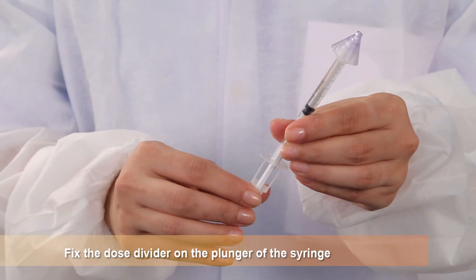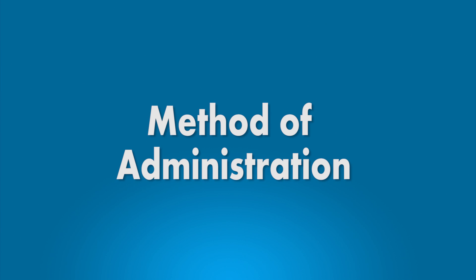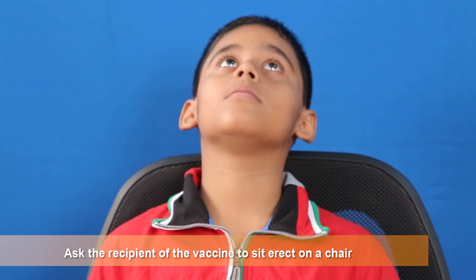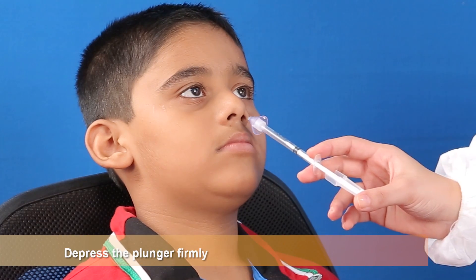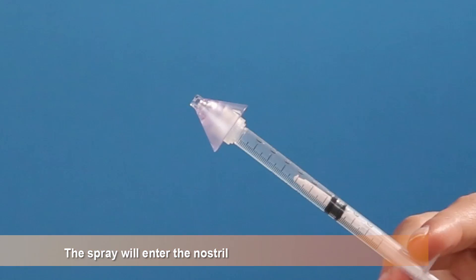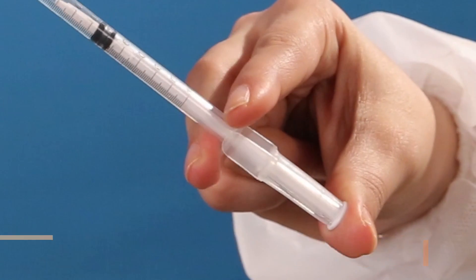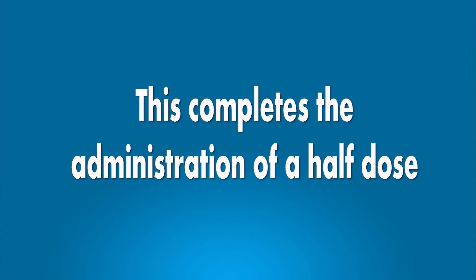Fix the dose divider on the plunger of the syringe. Method of administration: Ask the recipient of the vaccine to sit erect on a chair with head tilted back. Depress the plunger firmly. The spray will enter the nostril. The plunger will automatically be stopped because of the presence of the dose divider. This completes the administration of a half dose.